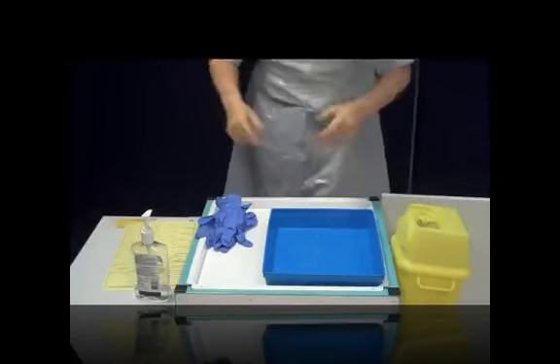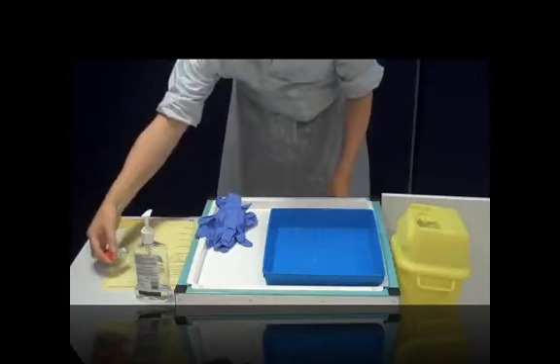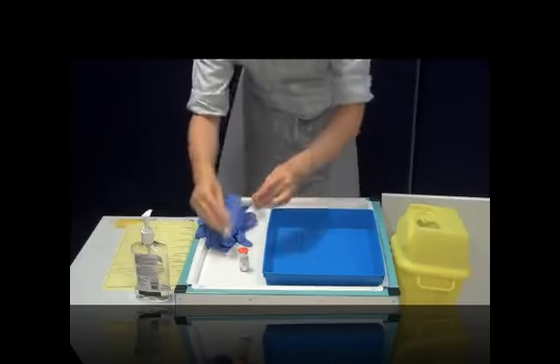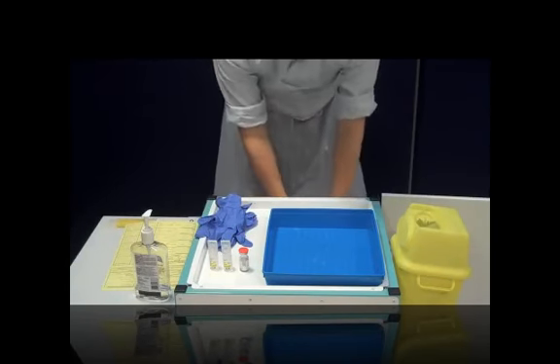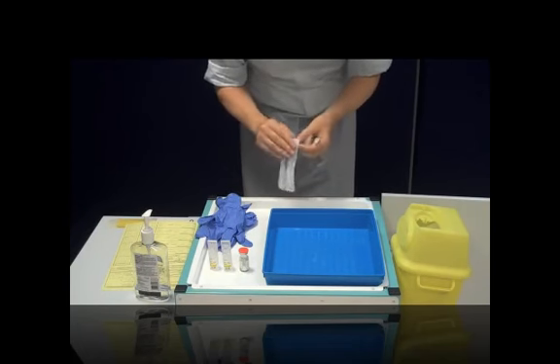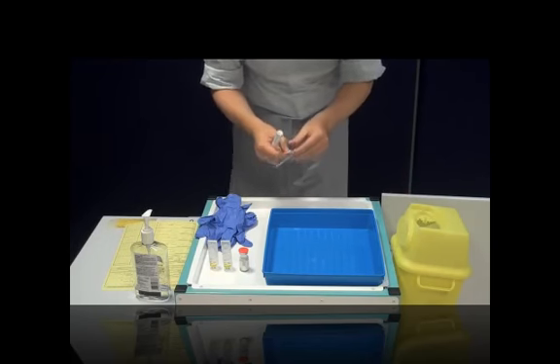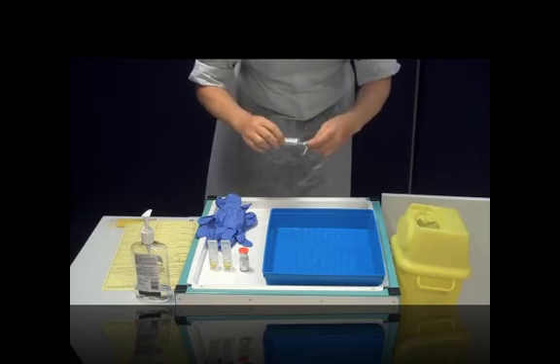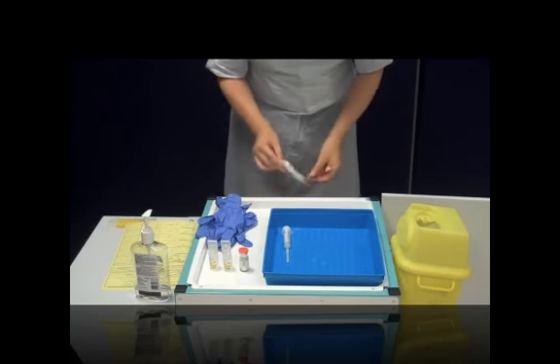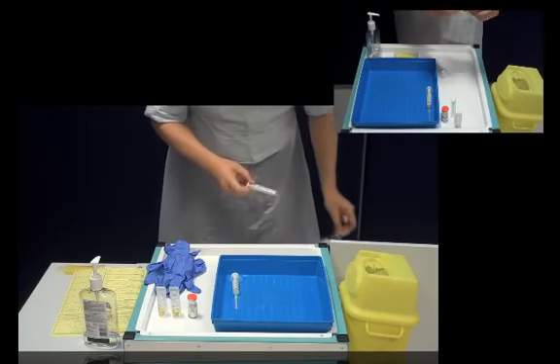So begin. Put on an apron, wash your hands and clean the ANTT tray, and then wash your hands again. Get out your equipment. So there's the antibiotic, there's the diluent for the antibiotic and a flush. Take the syringe and attach it to the needle. And that protects your key part so it can go in the ANTT tray. And then repeat with another one. The first one's for drawing out the flush, the second one is for drawing up your antibiotic.